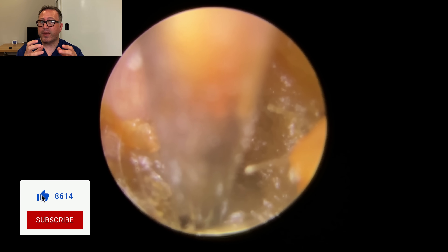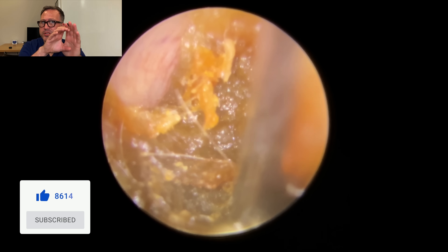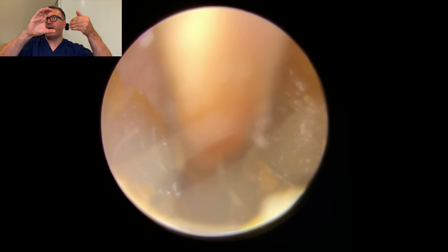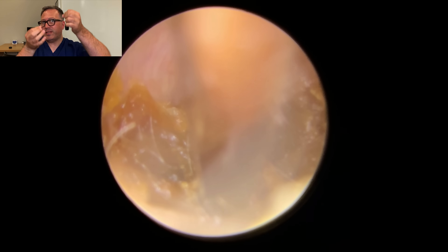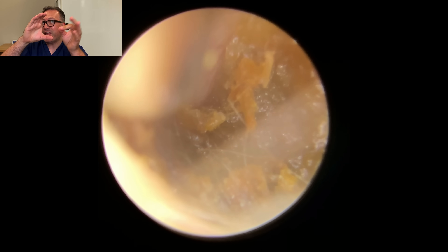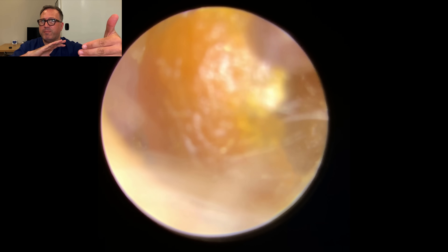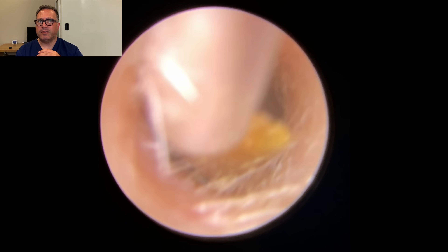You can see we're lifting now from the base of the canal. It's a very awkward shape — very narrow entrance, very long, and just as you go in, the canal drops. So what I'm doing here is trying to find the leading edge of this wax, trying to back up to the entrance, but where we've got this little ledge it was very difficult to accommodate the endoscope in there and see below that ledge and get the tool in as well. So I'm just gently probing there — you can see the edge just lifting away. We've got this long base layer of wax holding this in, and at the bottom end of the canal, closest to the eardrum, is this much harder layer that's been pushed down in.